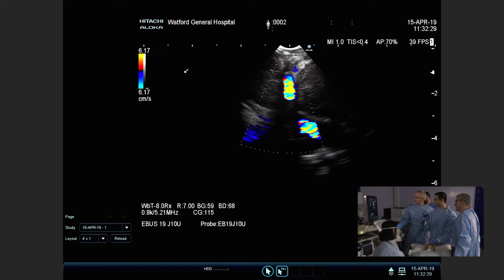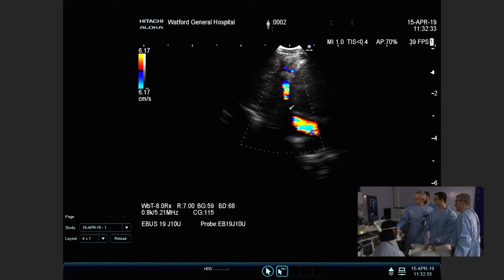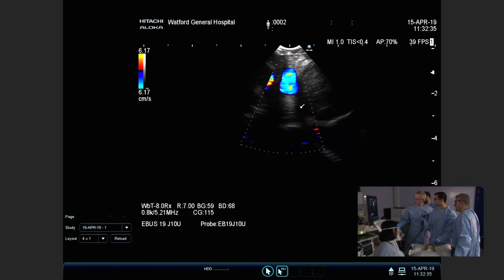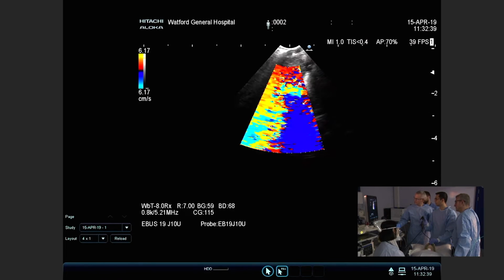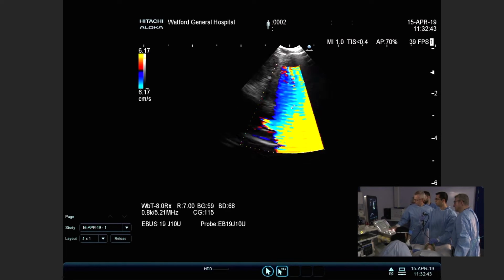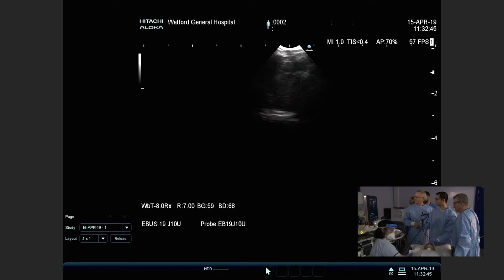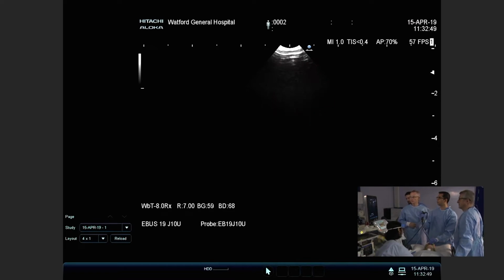Indeed. So SVC here, and then can you trace it, so it's actually coming off? It's really quite tight. So that's up at 12 o'clock. And then as I trace it down, it opens into the SVC. So it's got a bit of a cuff. So that's landmark number 5, and we'll quickly do landmark number 6, which is 4R.